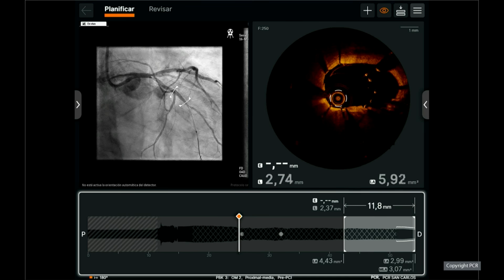Why don't we go back to the left main? That looks good. Yeah. Why don't we go back on the full screen on both operators, just to conclude the case with you, Javier, Nieves, and then you will move on with the case on your own. Let me show you an angiogram with some nitro, please, so you can see the result. Fluoro, please. Yeah.